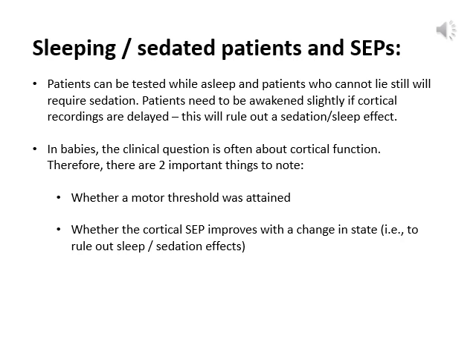Therefore, it is essential that the technologist indicate whether a motor threshold was attained, as this is the only indication of stimulation integrity. Also, it's very important to know whether the baby was sedated, sleeping, or slightly awakened, as sedation and sleep effects will reduce the amplitude and delay the latency of the cortical SEP.